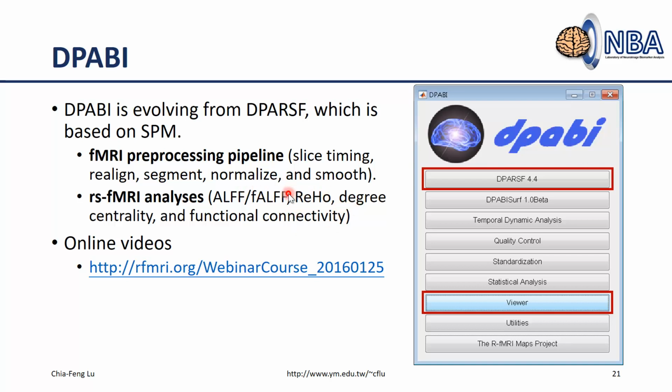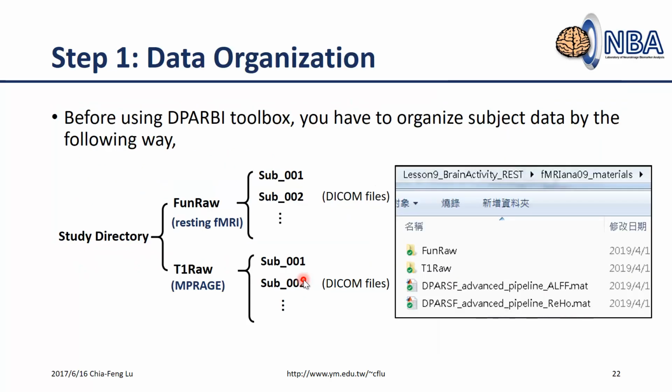Of course, there are several other analyses you can perform, but today we will focus on these two analyses. On the download website, you can find the original code, and the original author also provides online videos. So if you want to learn more detail about the DPABI platform, you can just visit the website.